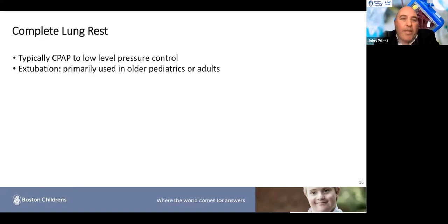They're probably most likely trached. And the combination of their native inspiratory tidal volumes and ECMO are going to be able to have them do trach collar sprints or potentially be on trach collar all the time, primarily helping them with rehab and going towards lung transplant.